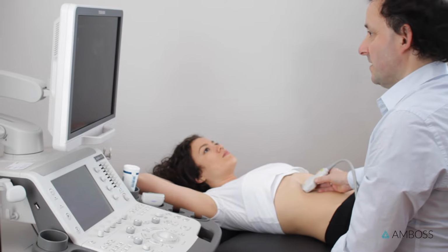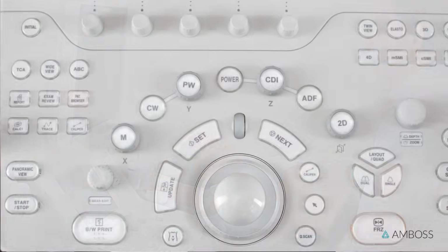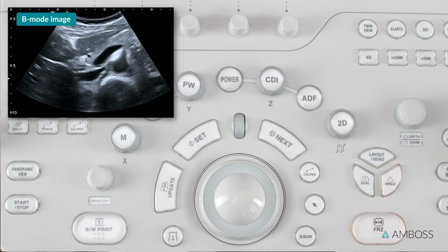To generate reliable images and interpret them correctly, you need to understand the basic functions of the ultrasound machine and how to set them up. Most important is learning how to set up the B-mode image, which you'll use in almost all scans.